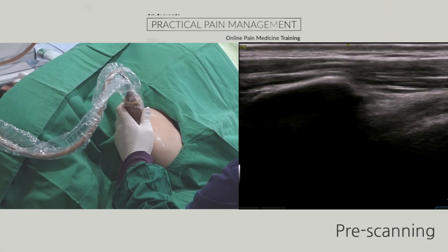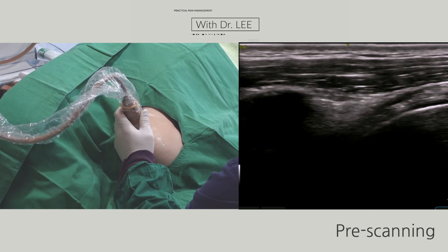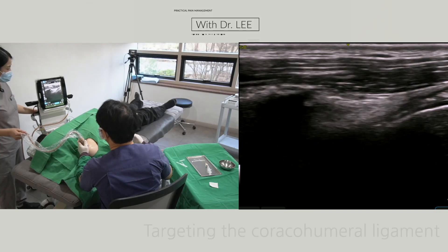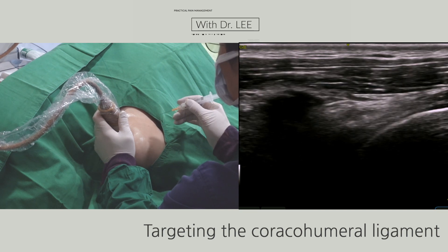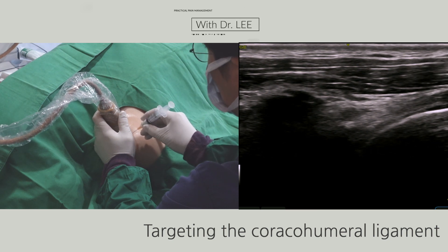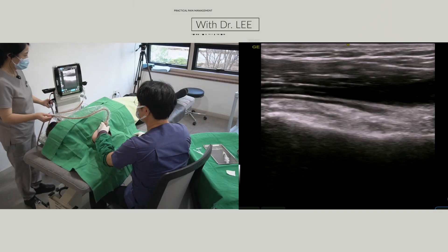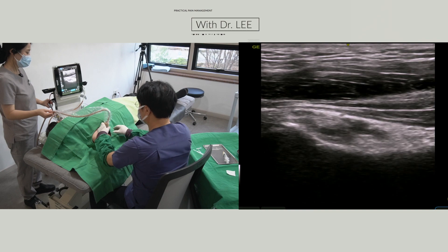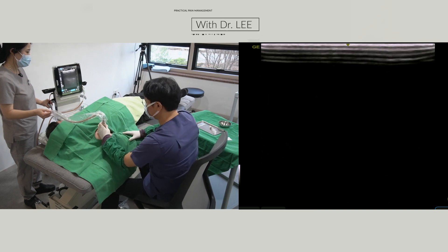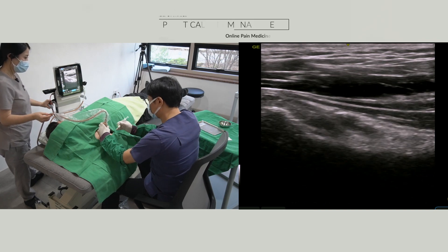Let's go to my operation room. Before holding the needle, I search the anatomic structures first. The first target is the coracohumeral ligament. My second target is the inferior capsule. My needle approaches from the anterior inferior to the superior posterior direction.